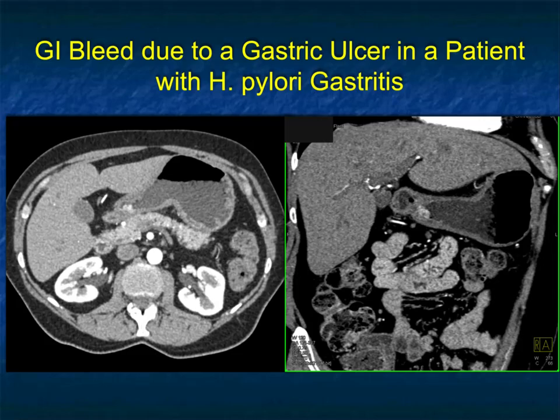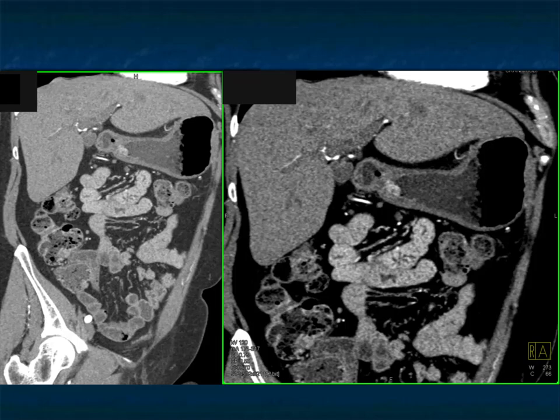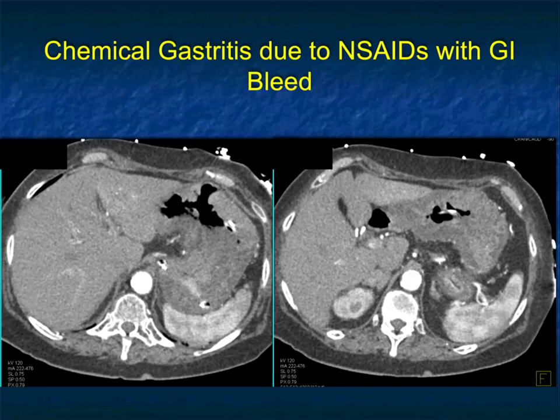Another patient has a GI bleed due to a gastric ulcer in the setting of H. pylori gastritis. There is a high-density zone in the antrum with thickening. While this is clearly a site of bleeding, one must be careful — you cannot exclude an underlying malignancy such as adenocarcinoma, so this patient will eventually be scoped. On coronal view, the thickening in the antrum and the high-density representing the bleed are very nicely shown.